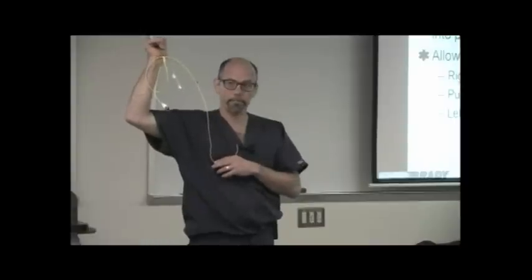I can see that when I give that fluid bolus, it has an immediate effect on the patient's cardiac output. So I can see the immediate effect of stretching the right ventricle, stretching the left ventricle a little bit more with some fluid, because now my cardiac output is better. I can see that with this catheter, okay? If I'm using drugs to do that, I can titrate up on the drugs or titrate down on the drugs and see immediately what the effect is on preload and cardiac output.